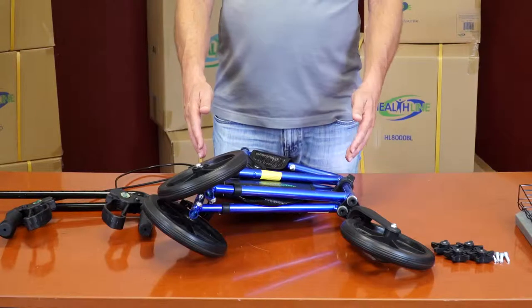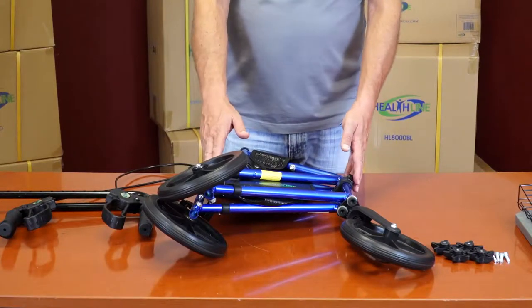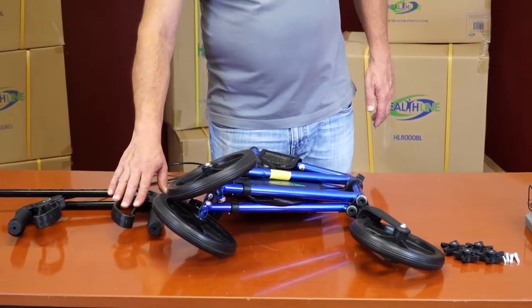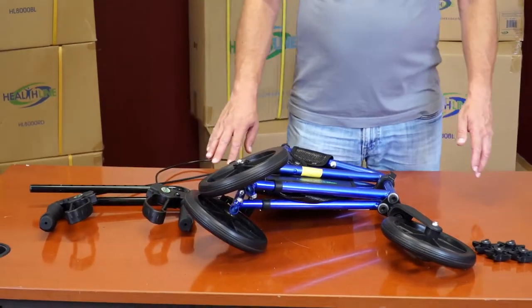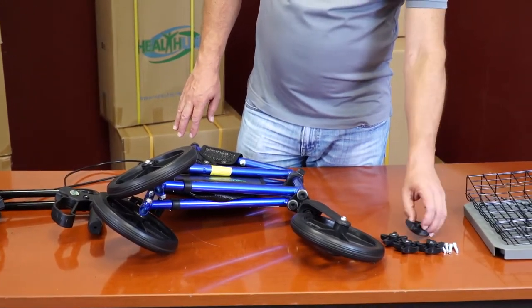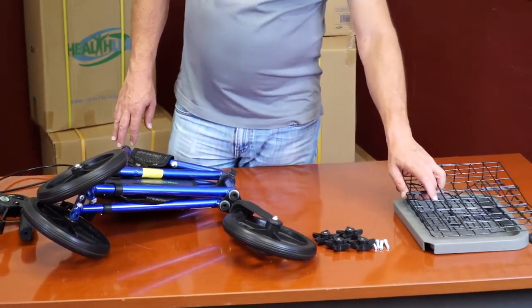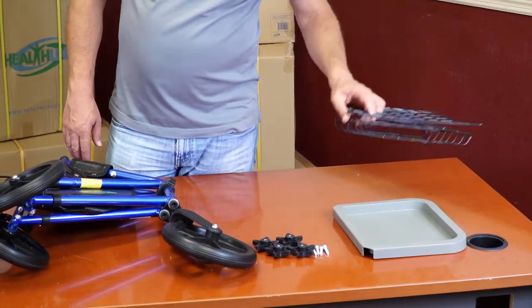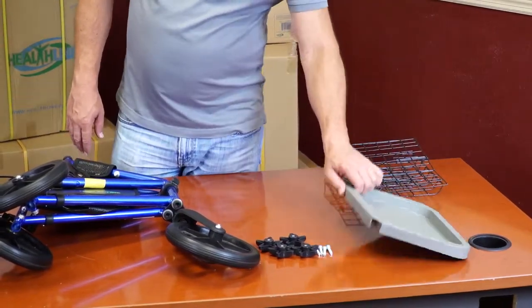The five parts are: the main Rollator frame assembly with wheels pre-installed, a pair of handlebars with hand brakes pre-installed, a set of plastic knobs and steel bolts, a wire basket assembly, and a plastic tray.